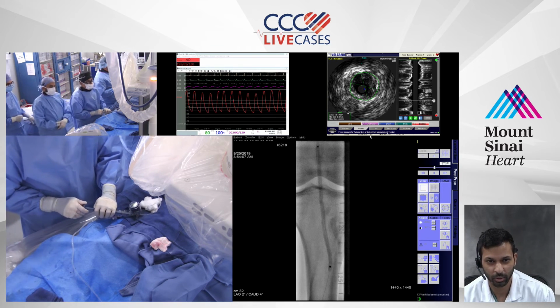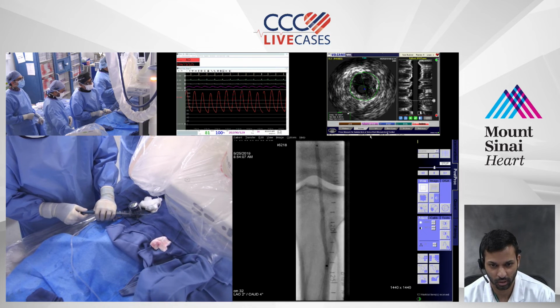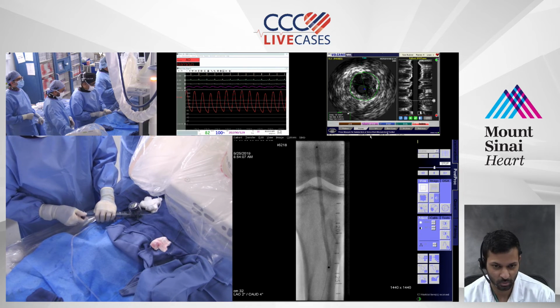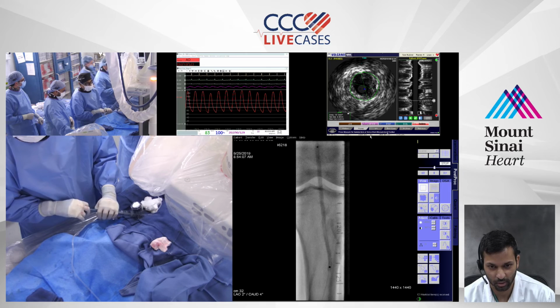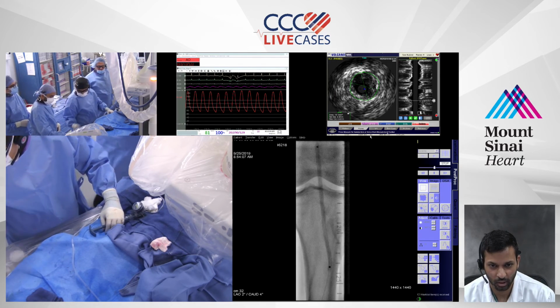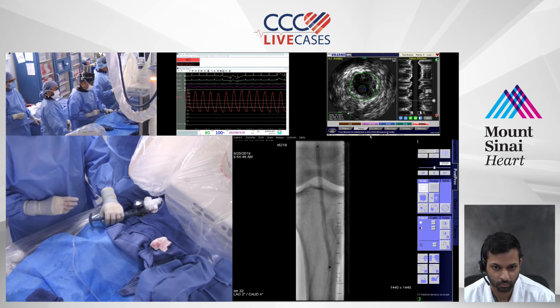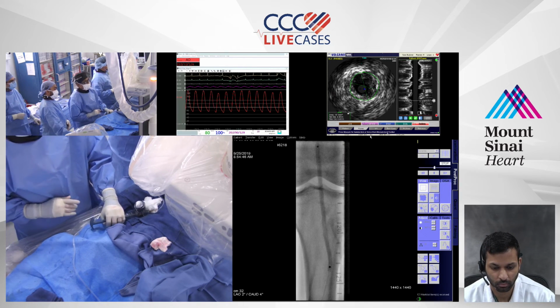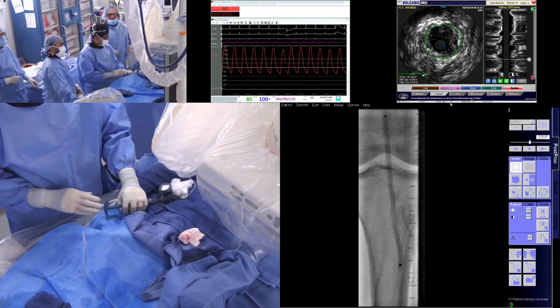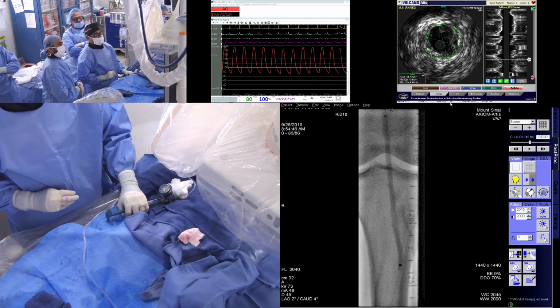I definitely agree with you. I think in a patient with CLI who is at high risk for restenosis or occlusion after intervention, it's perfectly acceptable to use, for 3 minutes. Like you said, I think this will definitely improve his patency. So I agree with you. All right, so here we're going to 8 atmospheres. Obviously, it's discomfort. We know he's going to have it. So we're going to watch paint dry for a little bit, and we'll discuss a little bit more.